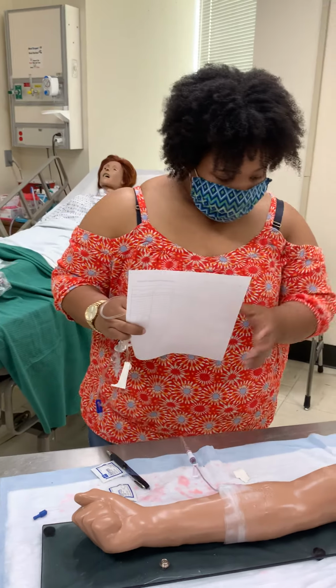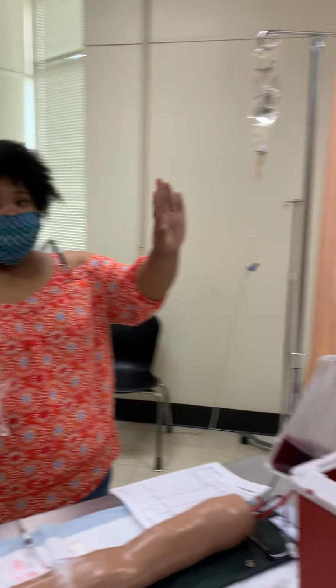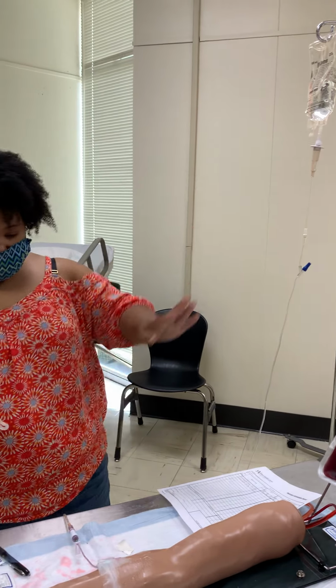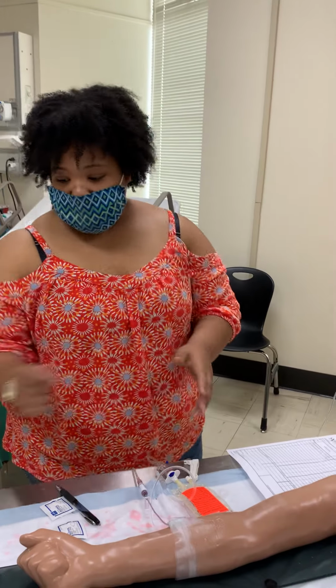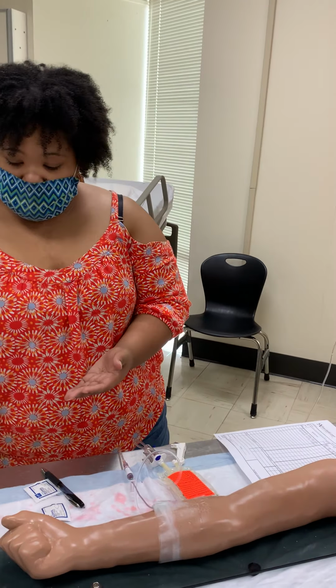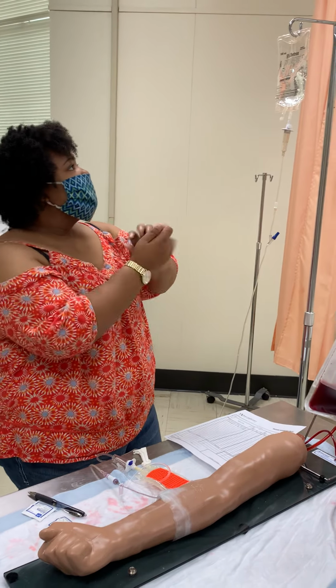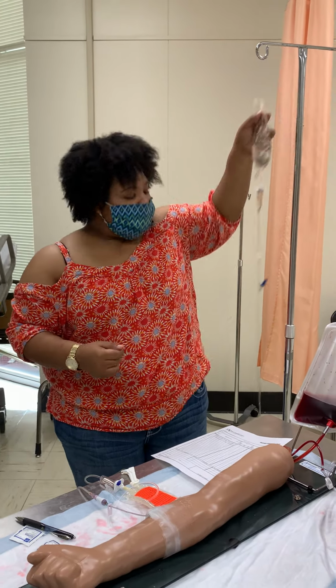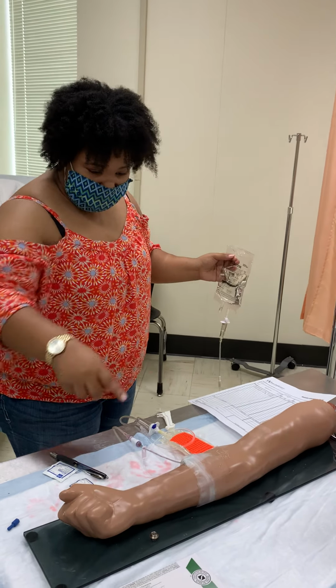All right. So also, I'm going to check for compatibility of what's already running. Okay, I'm going to wash my hands. And I need to check to make sure that the line is patent. And so I would get backflow.